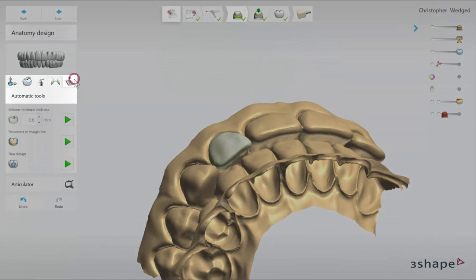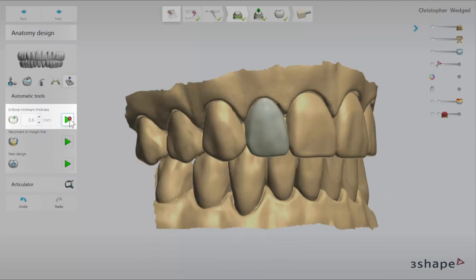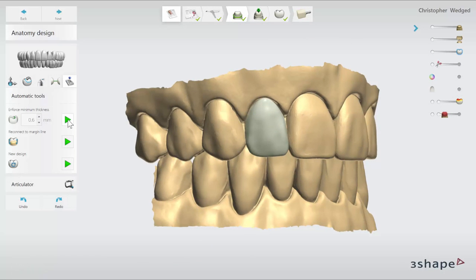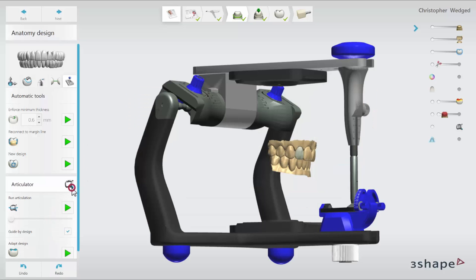At the end, go back to automatic tools where you can set the recommended value of the minimum thickness and enforce it. Then click on enforce minimum thickness to be sure that the design meets the material requirements and check how it may affect your design. If the minimum thickness has not been violated, there will not be any visible changes. At every step of designing a restoration, you can use the virtual dynamic articulator to check contact points of the restoration in dynamic occlusion.